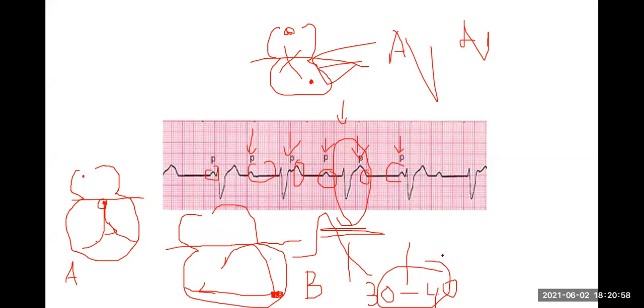And actually, we know the breadth or the size of the QRS complex determines prognosis. So essentially, this fellow has a better prognosis. He has a narrower-ish QRS complex, whereas this guy has a very poor prognosis. So yes, the QRS complex can be narrow, but not completely normal. The smaller the width of the QRS complex, the better. That's because you asked the question: it will be broad, but how broad depends on where it starts, because the escape rhythm starts more distally.